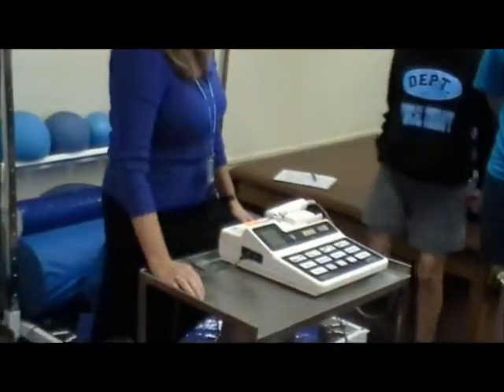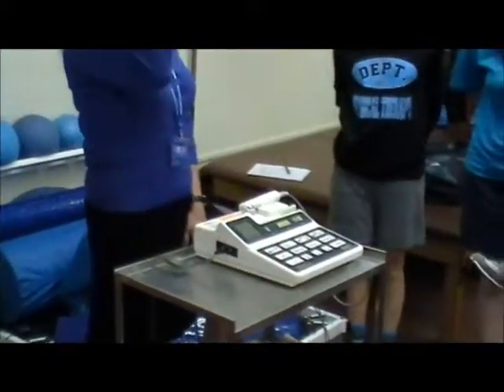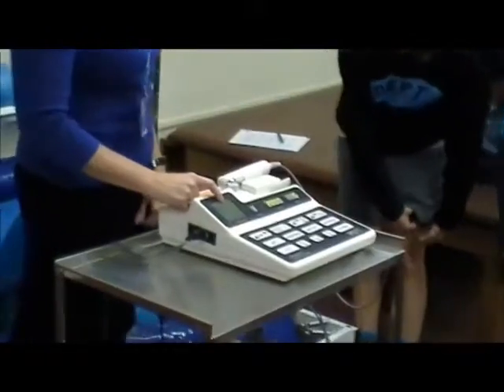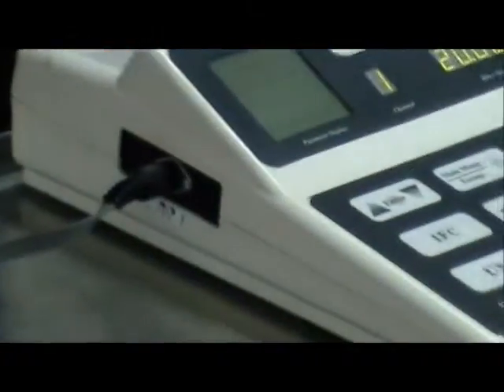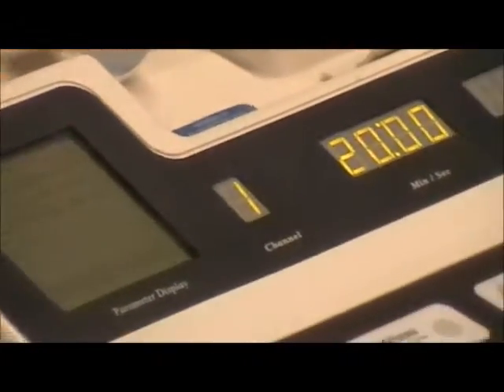See, it knows you're doing interferential, and it gives you choices just like it did on ultrasound, okay? The first thing it says is channel selector, and it automatically defaults to both channels, channel 1 and channel 2. With some of the others, you could do channel 1 and channel 2, or just channel 1 or just channel 2, but we need 4 pads, 2 channels, and so it automatically goes to both channels, all right?